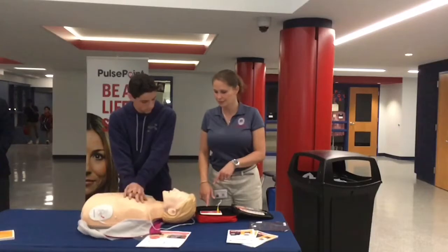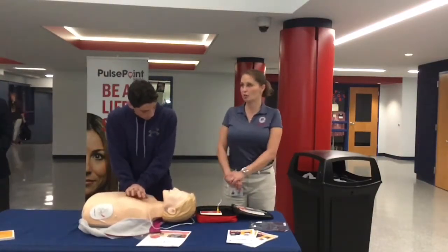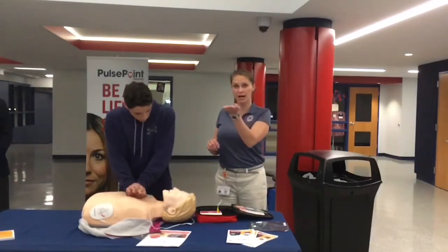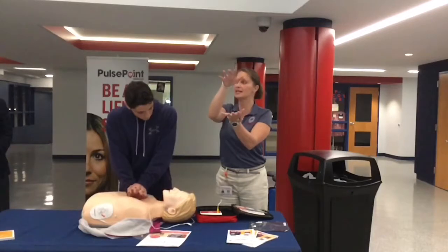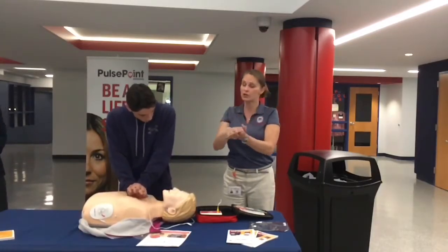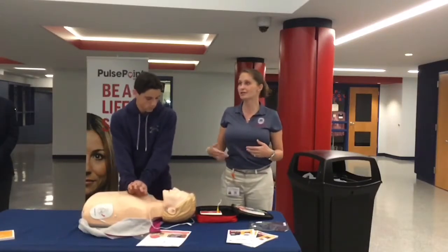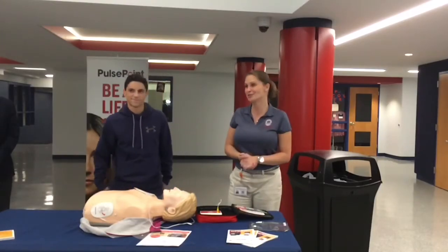One thing to notice is how fast it is. The key to hands-only CPR is to compress fast and hard — you want to be going at least two inches in depth, because what you're doing is compressing the heart against the spine and your hands, squeezing blood in and out of the heart. You can hear how fast it wants you to go — between 100 and 120 beats per minute. If you don't have a metronome, it's the same rhythm as the song 'Staying Alive,' so you can sing that in your head while you do it.